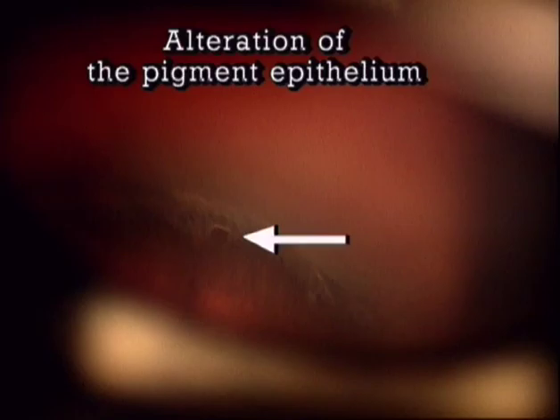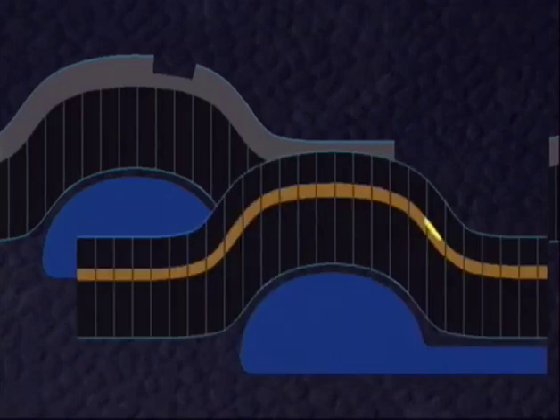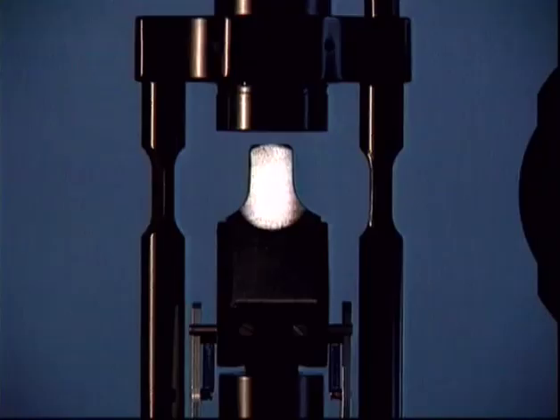To summarize the strategy for taking advantage of scleral indentation with changing transparency, if the goal of observation is the retina proper, place it at the top of the indented protuberance. If the goal of observation is behind the retina, place it in front of the protuberance.